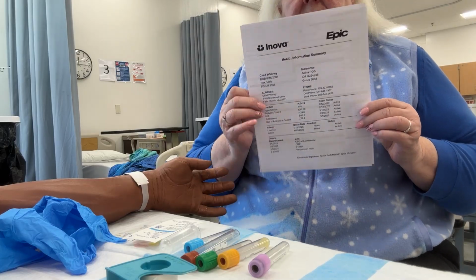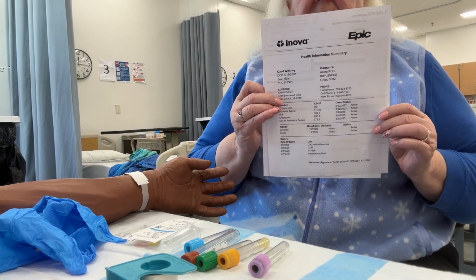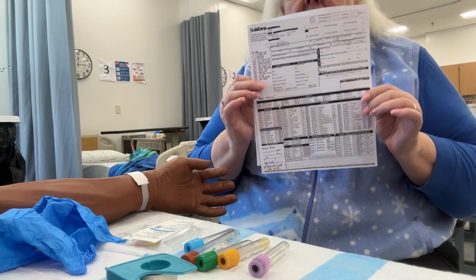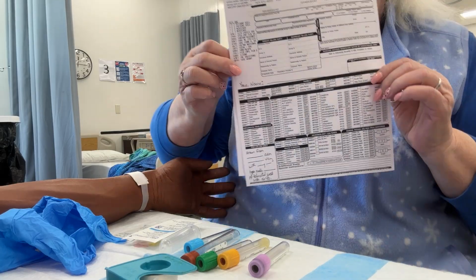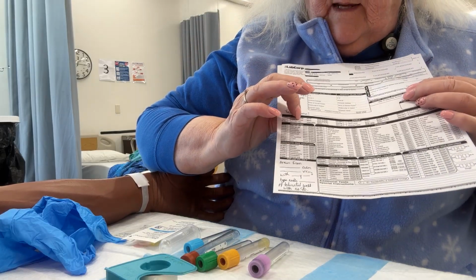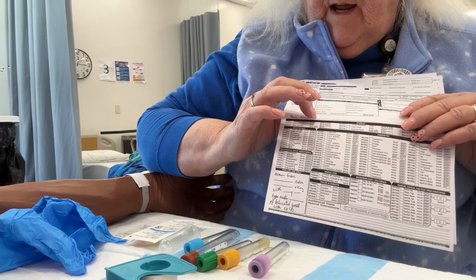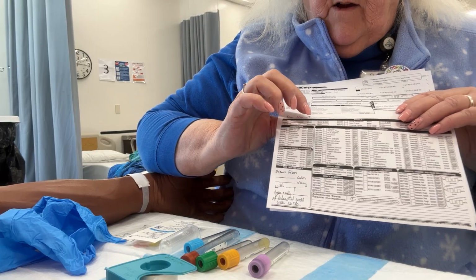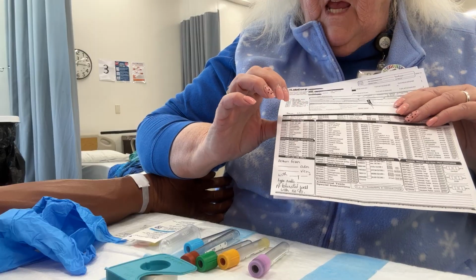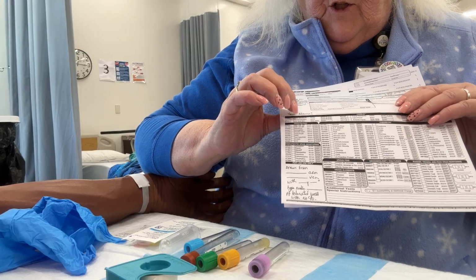You're going to have this patient, and on the back of this patient information sheet is a lab slip. You're going to complete the lab slip. If you'll notice on the lab slip, for example, basic metabolic, it gives you the number for the test, and if you keep going, it tells you what tube to draw, okay? You're going to mark the test that you want.